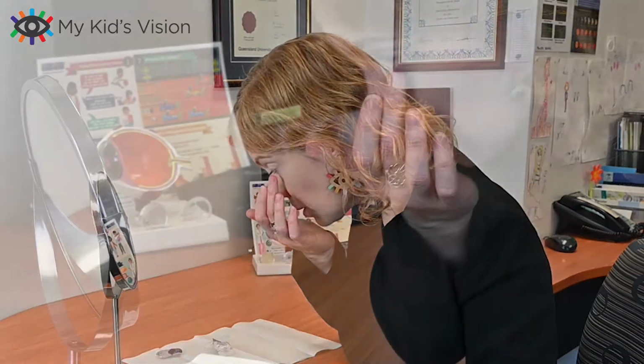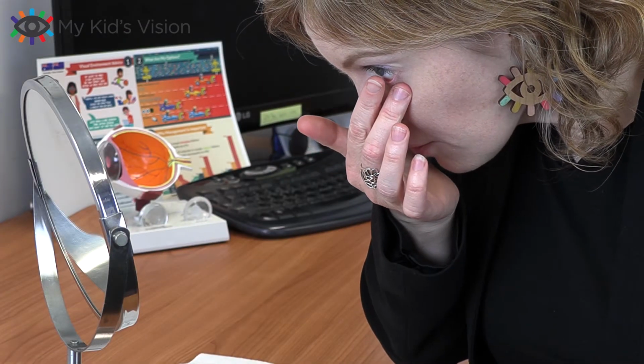Now when we're looking in the mirror, we can make sure we just touch the edge of the colour part of the eye, which is actually touching the contact lens. You put a little bit of pressure on and slide down. Bring your thumb in and pinch it off. If you slide down and let go and blink, the lens just spits right back up to where it's meant to fit.